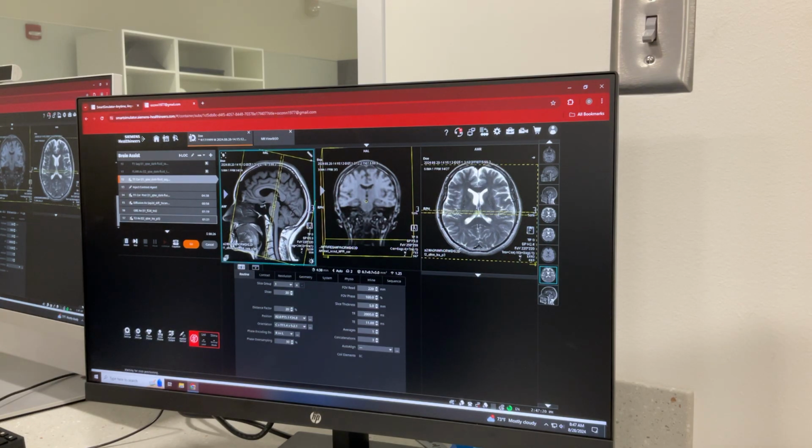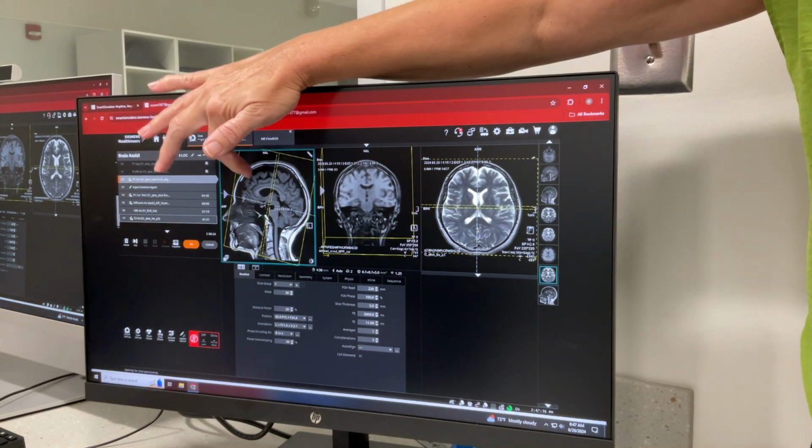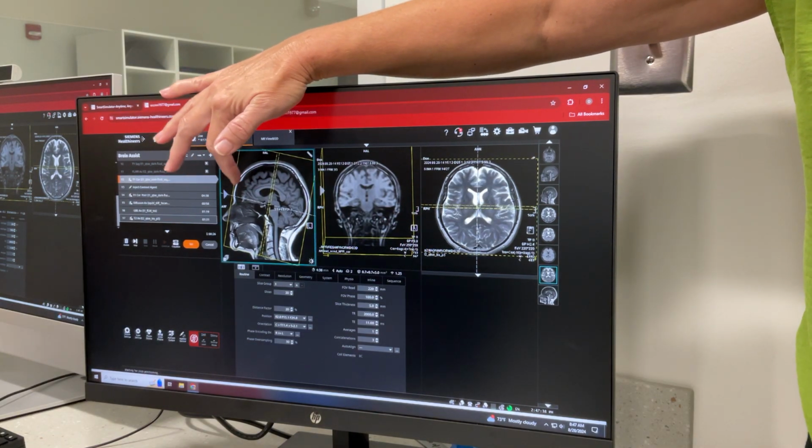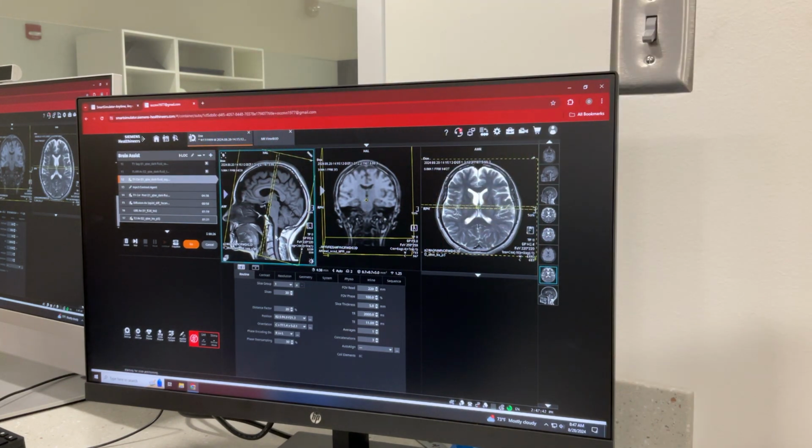What's our coverage? What do we want to make sure we cover and include anteriorly? The frontal sinus. See this dark area right in there? That's your frontal sinus. We want to cover the frontal sinus all the way back posteriorly.